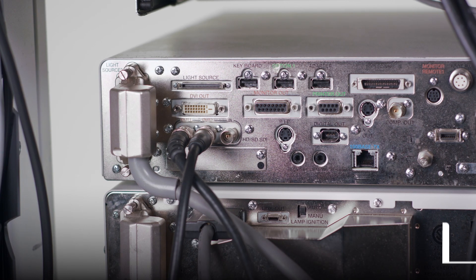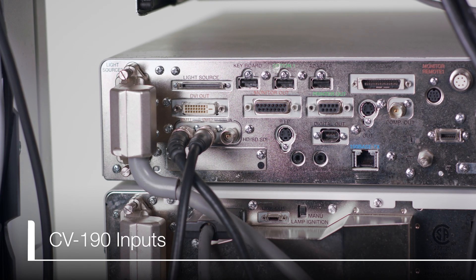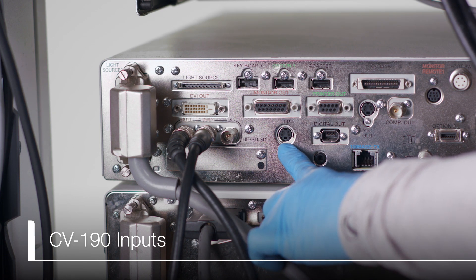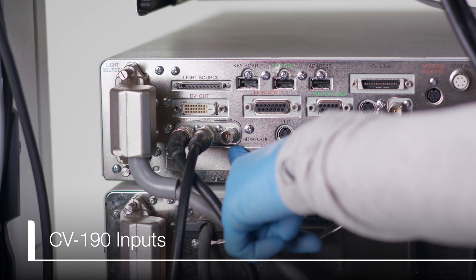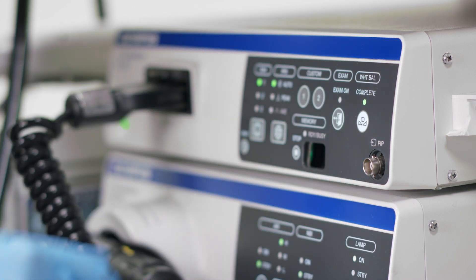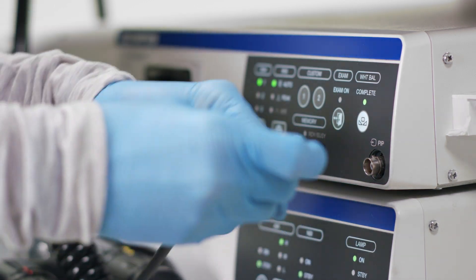The YC, Composite, and SDI outputs can also be used for the picture-in-picture function. The YC and SDI picture-in-picture connections are located in the back of the CV190. The composite picture-in-picture connection is located on the front of the CV190.